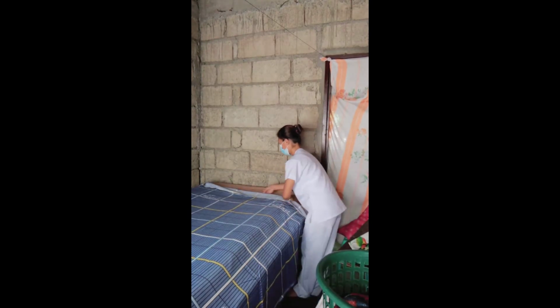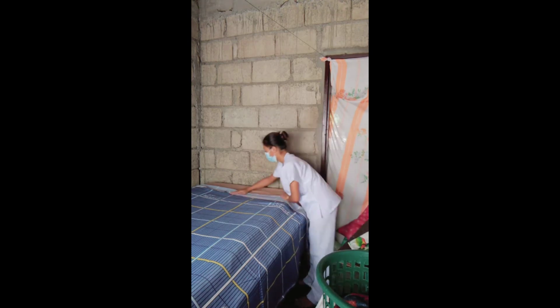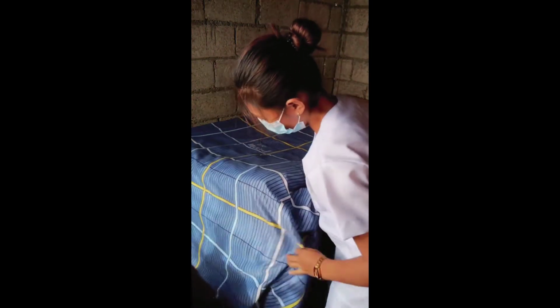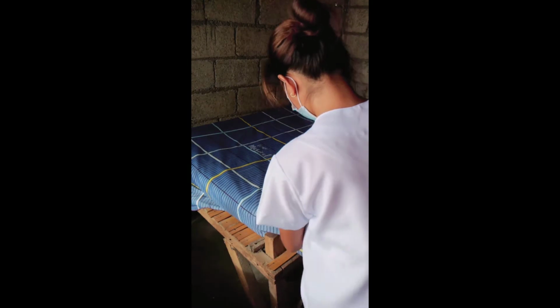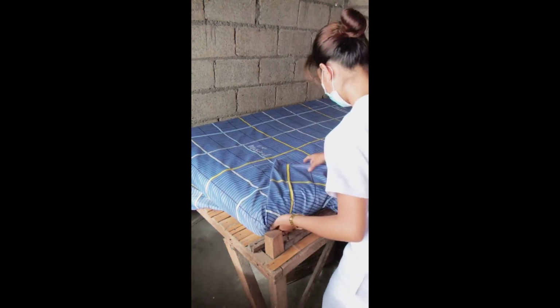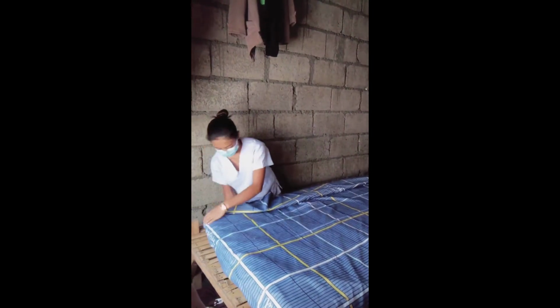Now make a cuff. At one side of the foot of the bed, lift the mattress corner with one hand, and with the other hand, tuck all the top linens together under the mattress, then make a modified mitered corner at the top sheet and blanket. Now, move to the other side and finish making the bed.